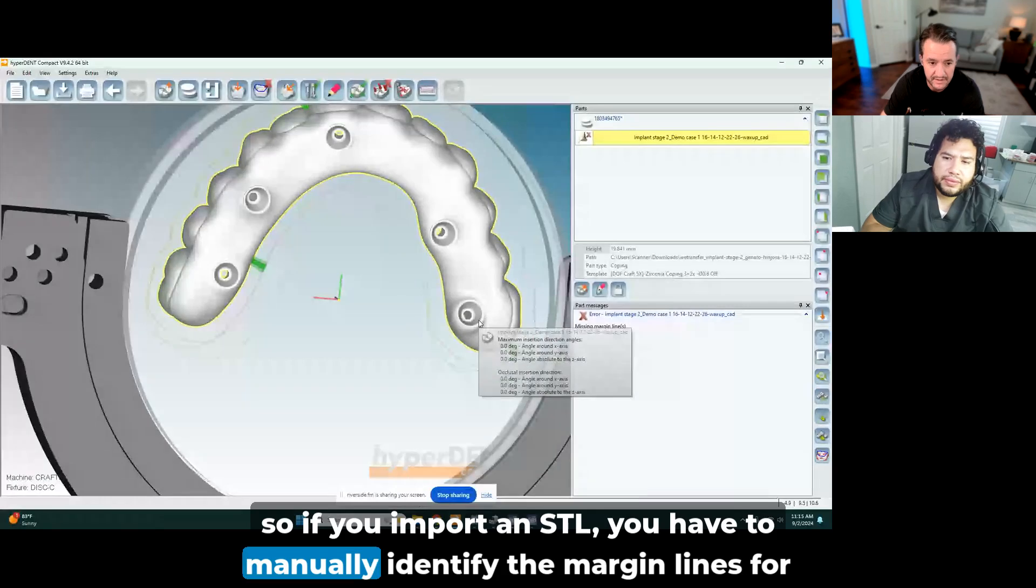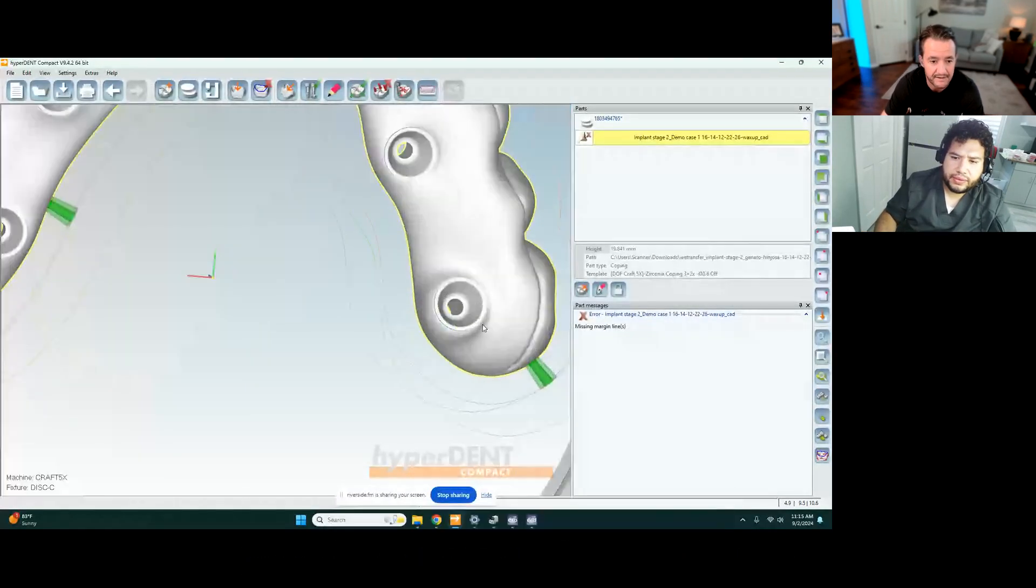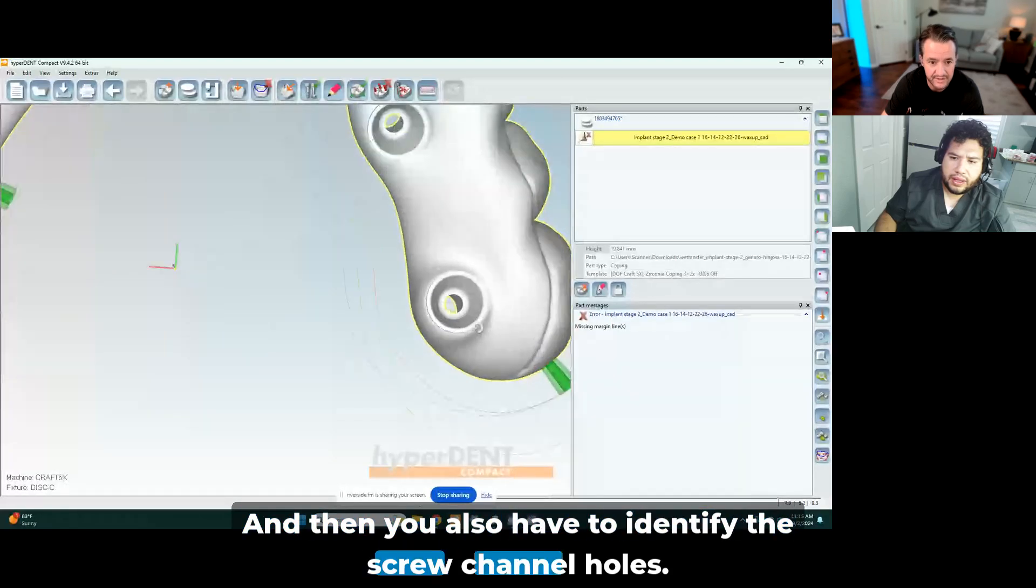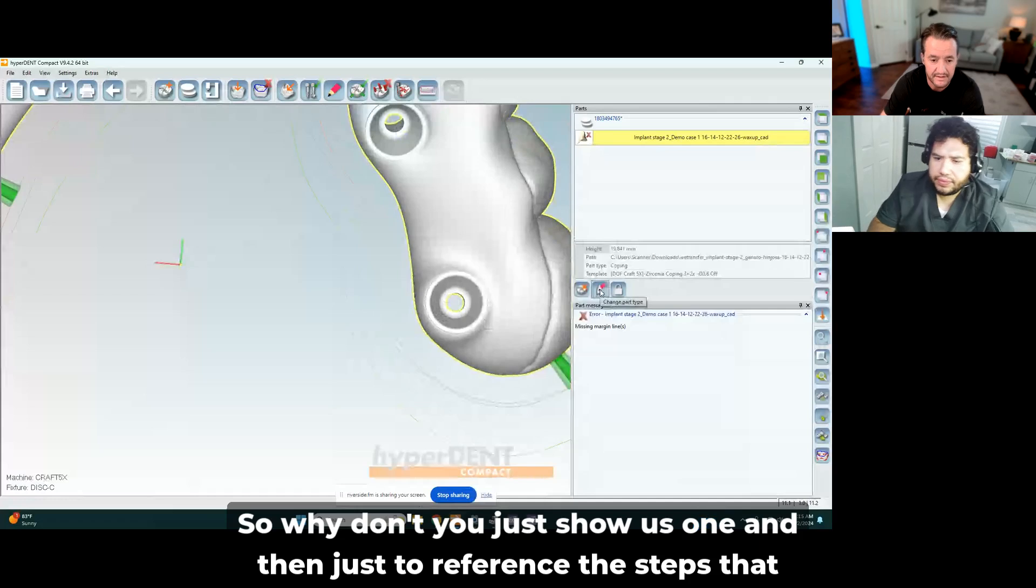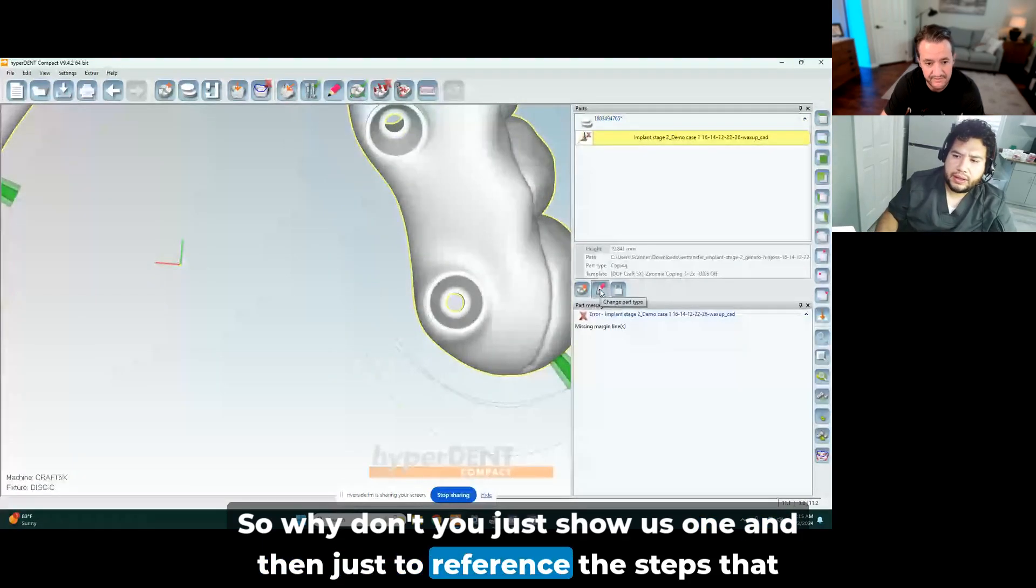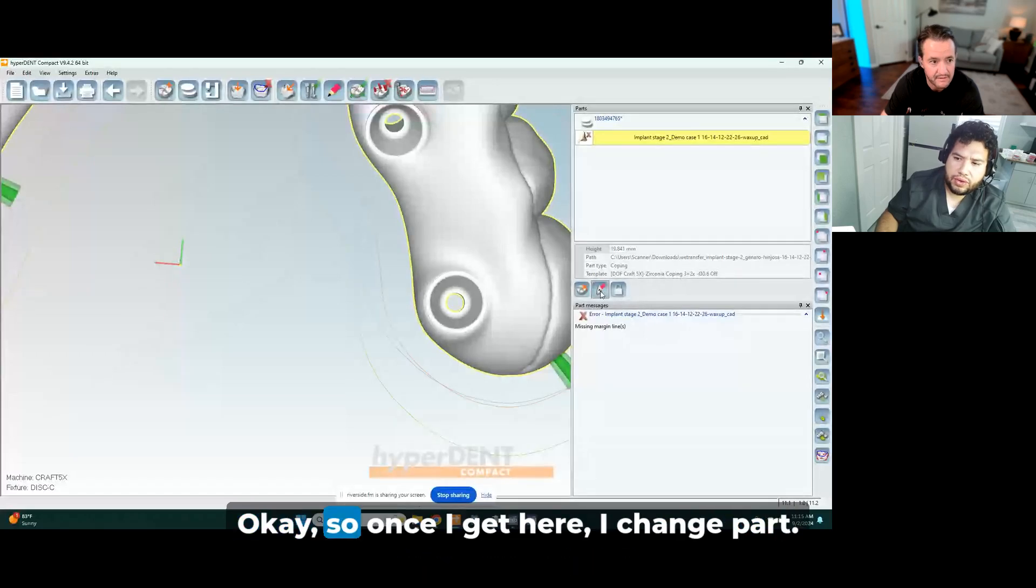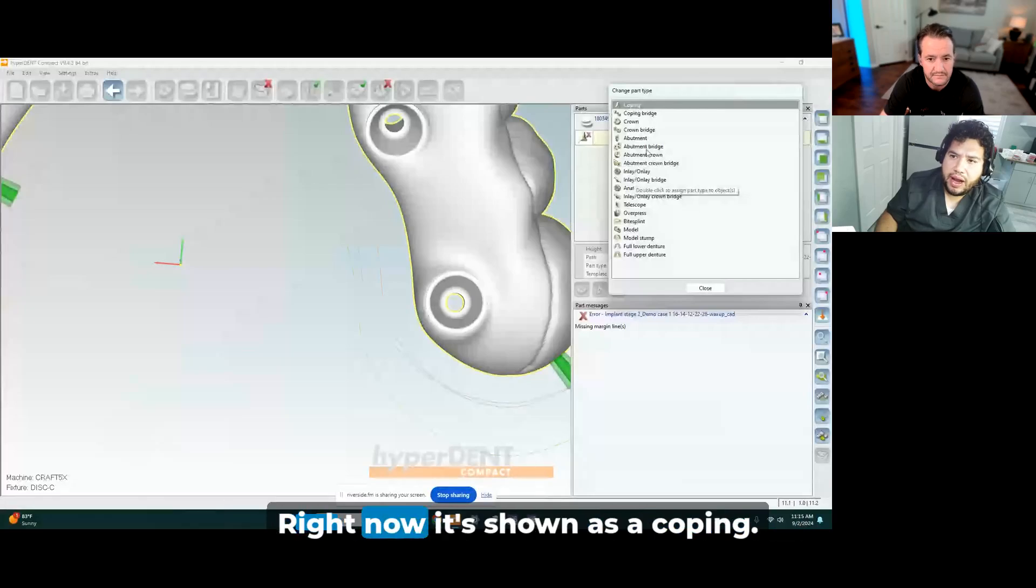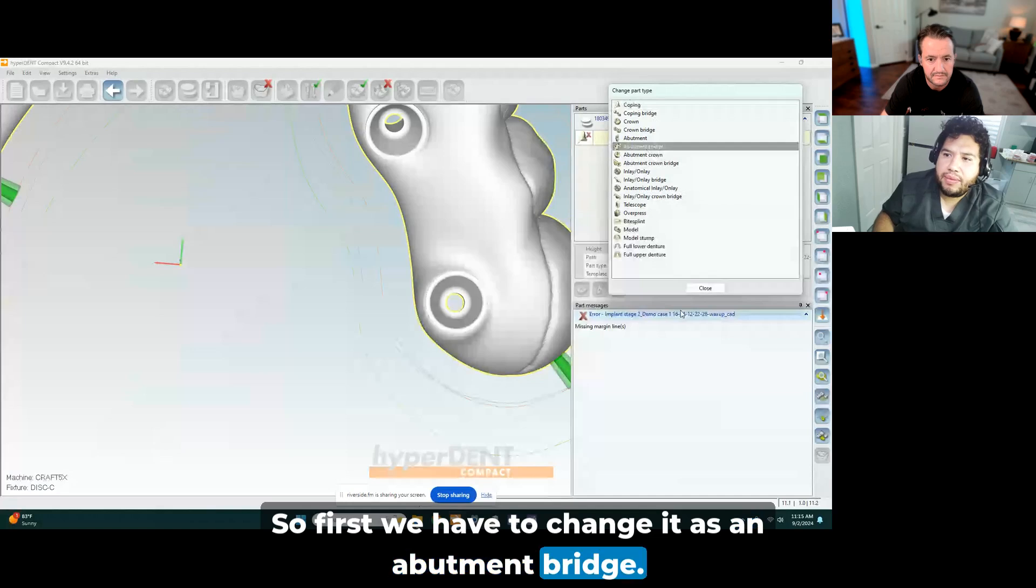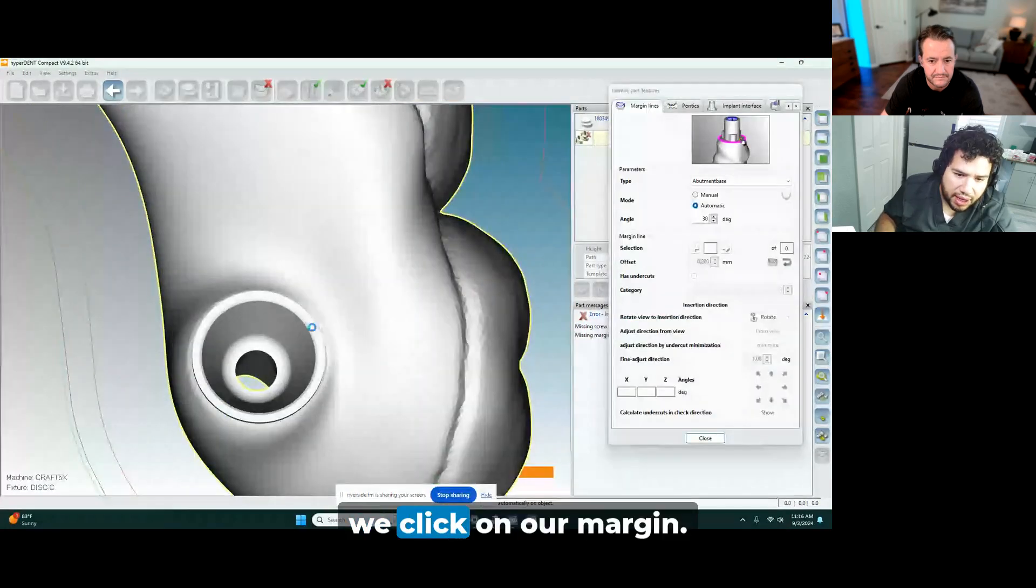So if you import an STL, you have to manually identify the margin lines for that multi-unit interface, and then you also have to identify the screw channel holes. So first we have to change it as an abutment bridge. We go to identify parts, three features, we click here, we click on our margin.